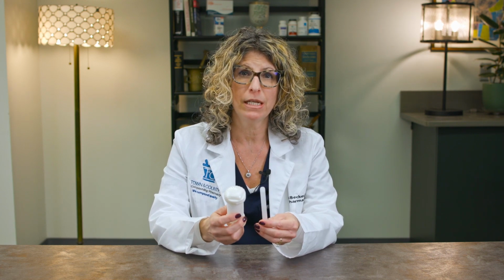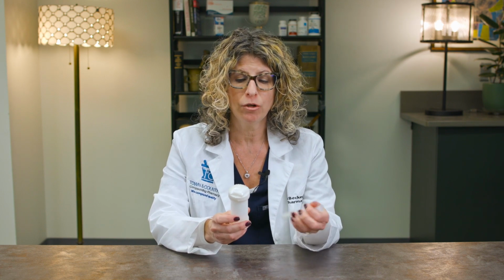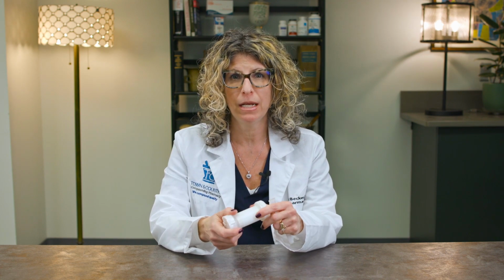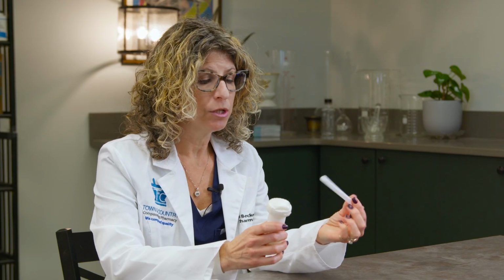Today I'm going to show you how to use a Topi-Click Perl device. This is a device that you would receive if you had a vaginal prescription that you were being administered. Your prescription label will indicate how many clicks you're supposed to use each time you use the cream. Each one of your prescriptions comes with an applicator as well.